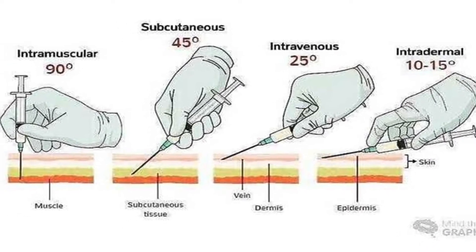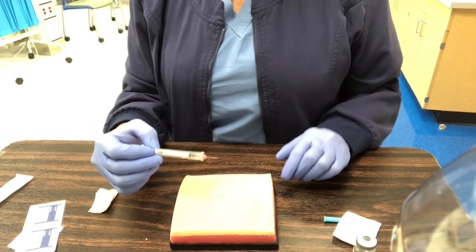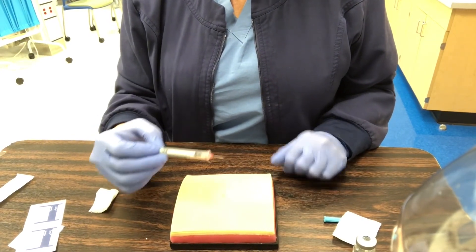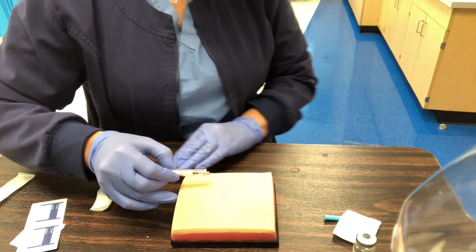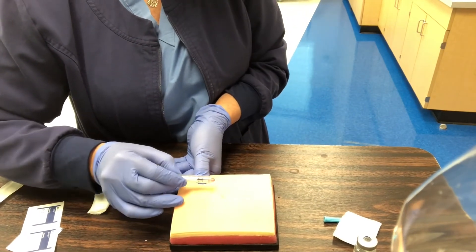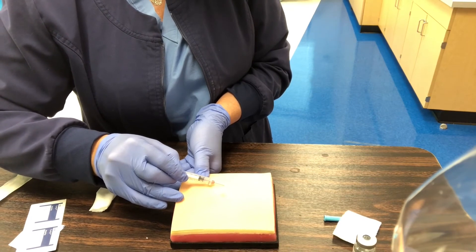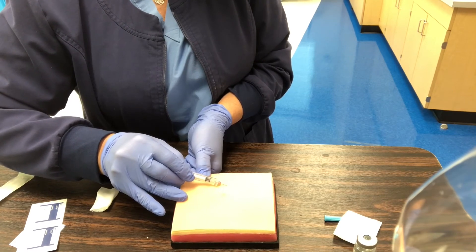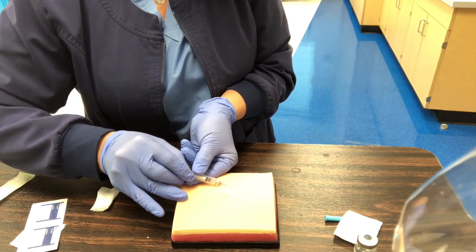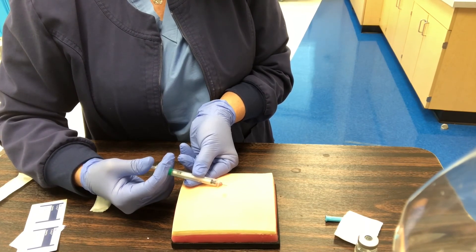One thing I want to show is the angle from a different view. If I am going in with an intradermal, I'm 10 to 15 degrees above the skin. I would have pulled the skin down taut and go under at that angle. Notice my ring finger banking the needle as I go in. I release the skin with my non-dominant hand while holding the syringe and gently inject for an intradermal injection.